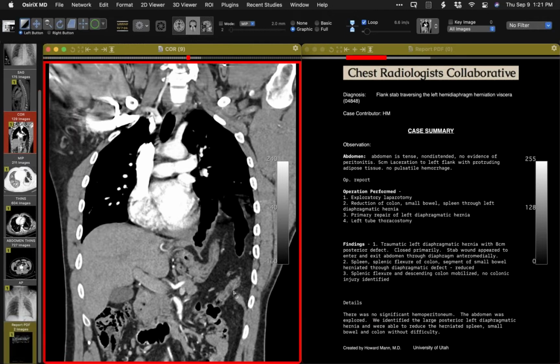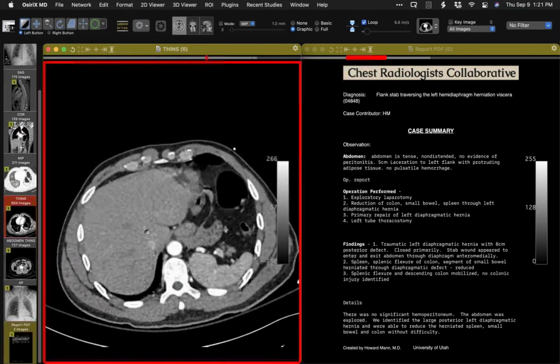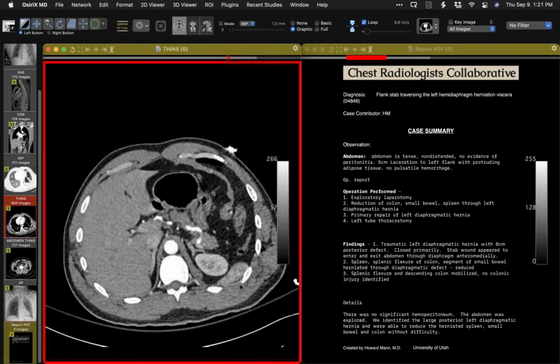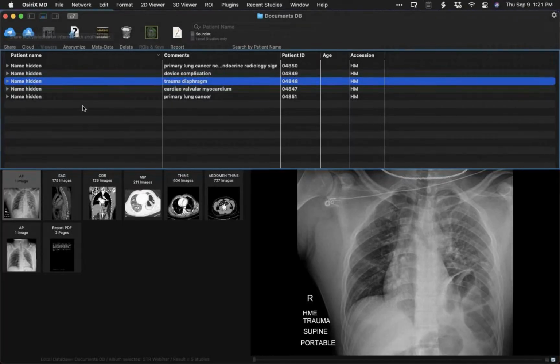Right. And if you look, your images showed that sort of thickened, retracted fragment, or not fragment, but fiber, that suggests that's exactly what's happened. Yeah, that it's kind of balled up and retracted into a thicker knob right there like that. Exactly. Yeah, pretty impressive. He was lucky. Didn't get too much else.